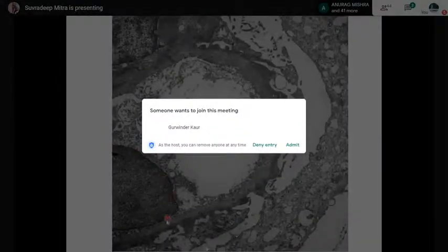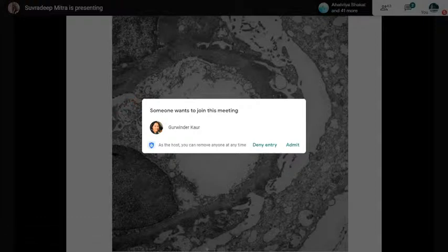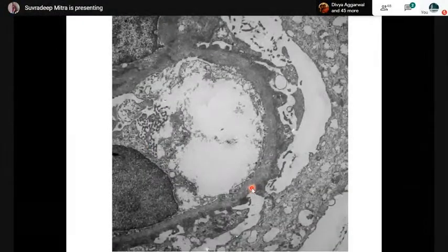Of course, you can see the endothelial cell nucleus, at least part of it. And if you look at the cytoplasm of the endothelial cell, it's not very well visualized because there is usually a very scant amount of cytoplasm of the endothelial cell, and when it swells up, we term it as endotheliosis. But if you look very closely at this particular electron microscopic picture, I'll also show the higher magnification. You can also see that there is a little thinner kind of layer which has some fenestrations or gaps in it, which are known as endothelial fenestrae. I will discuss this.